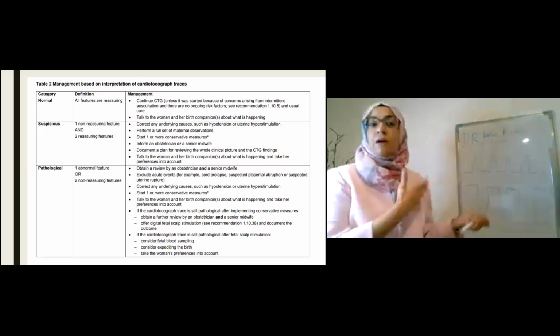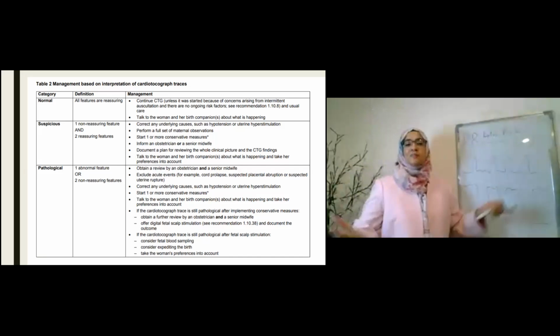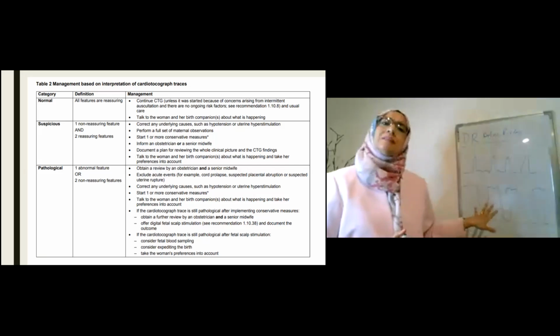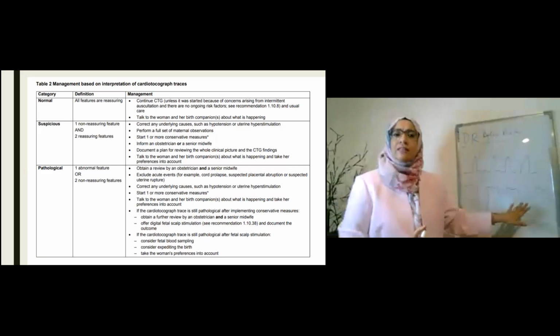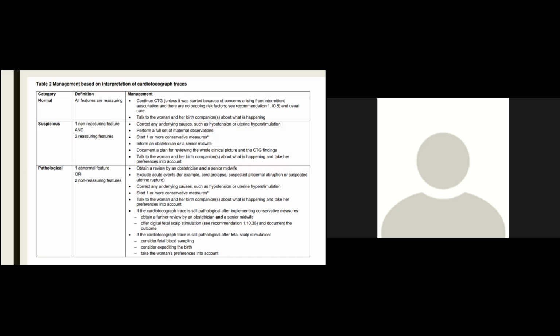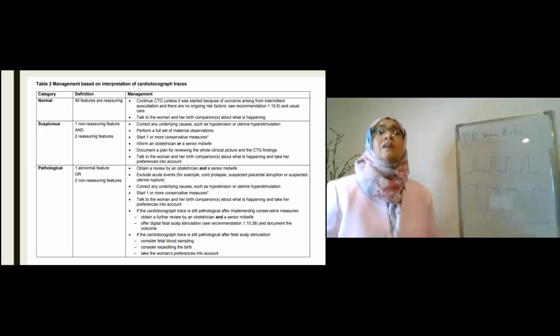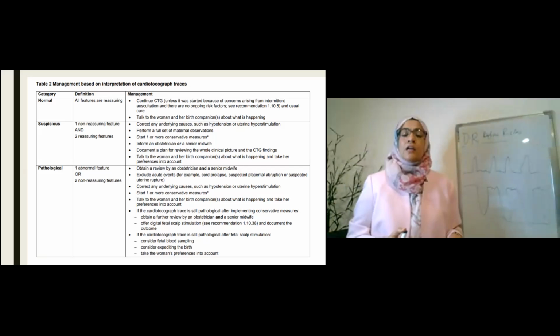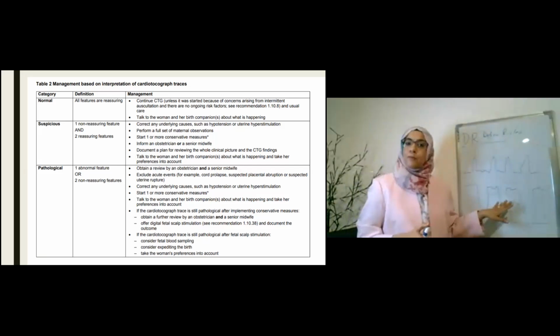Just by drawing this, my heart rate goes up. I'm just drawing it. There's no baby attached to it. My heart rate goes up when I draw this kind of CTGs. Anybody happy? You want this baby delivered. Either vaginally, put a forceps, get it out, do a section. Can't be having this baby who's just going deep in the water, coming up and saying help, and then goes down again, right?